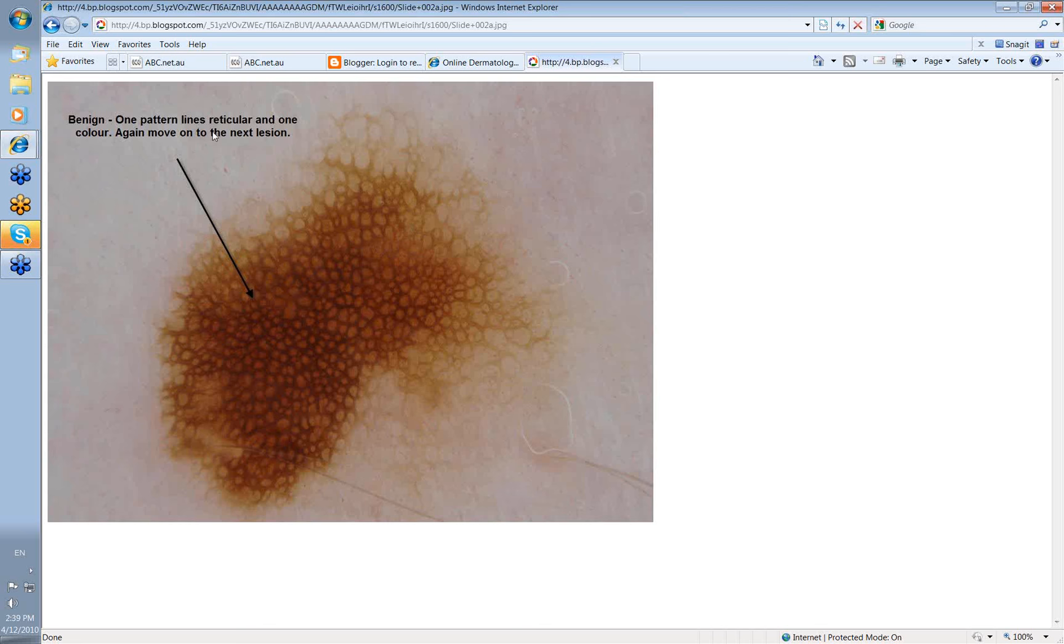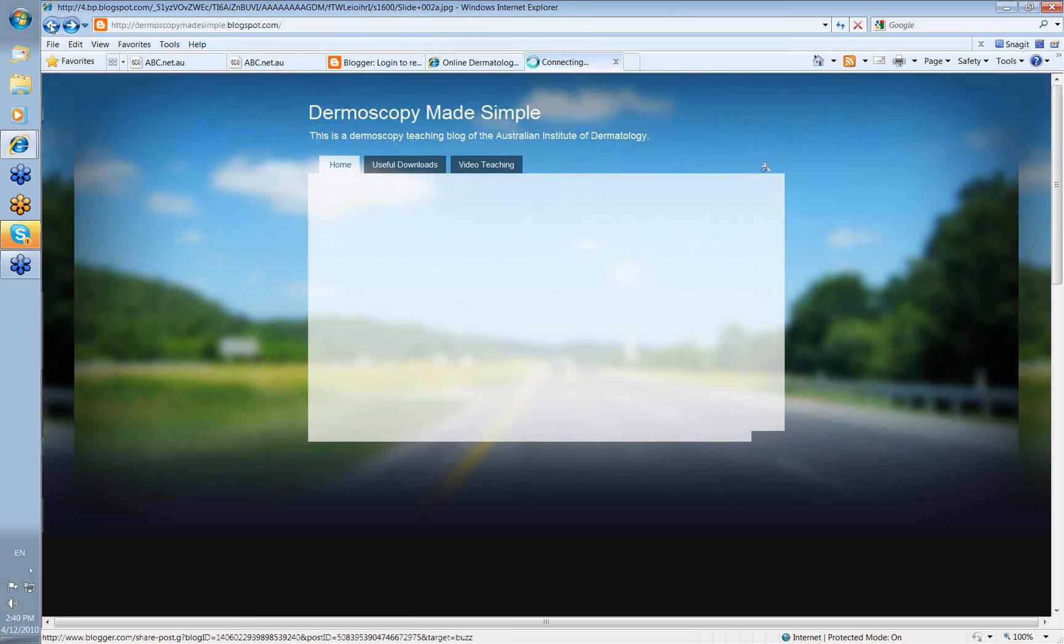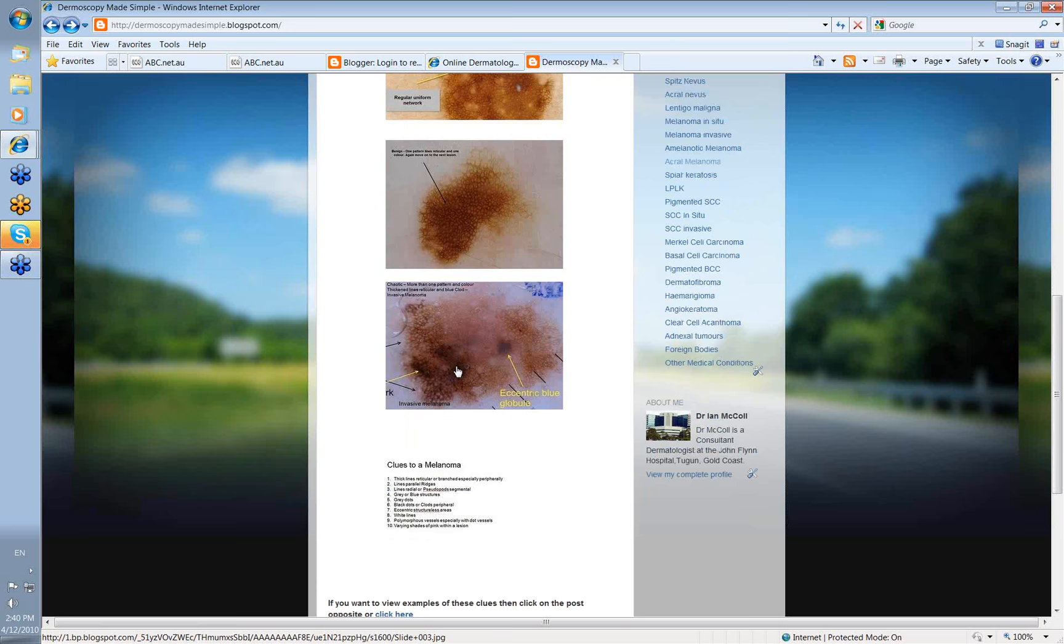Similarly, look at this one. Again, benign. One pattern, lines reticular and one color. Move on to the next lesion. You can scan someone's back very, very quickly if you're simply looking at these features.